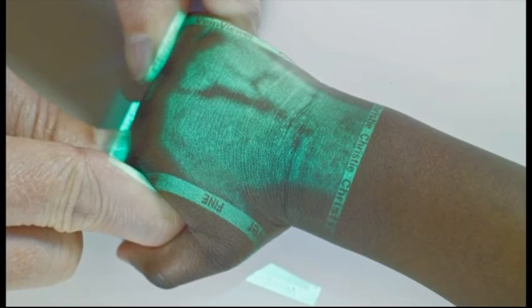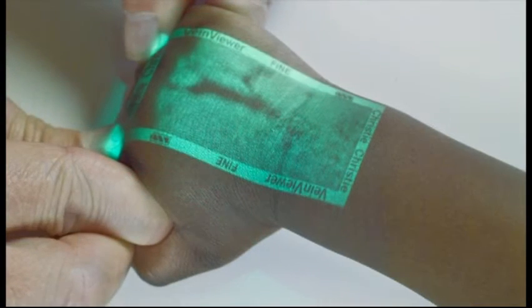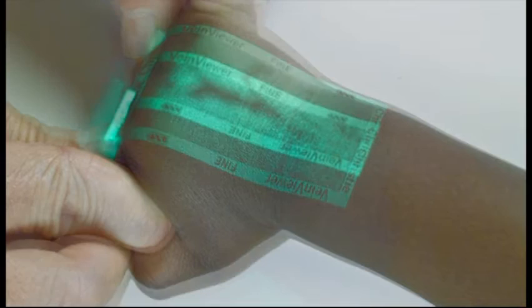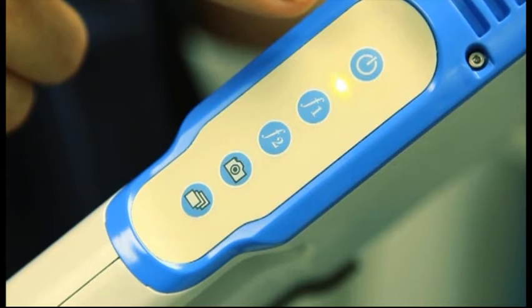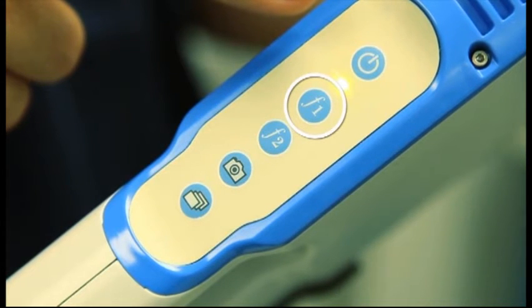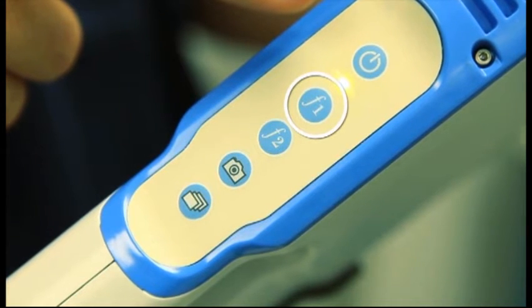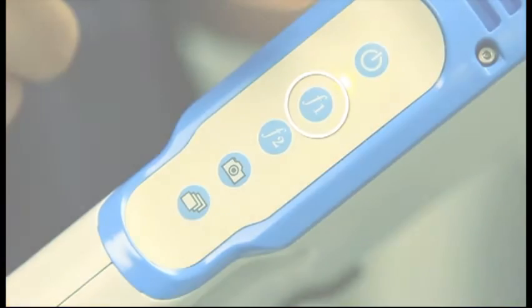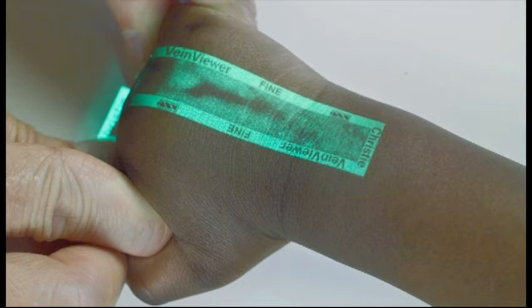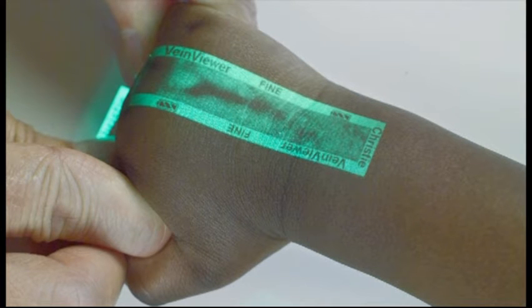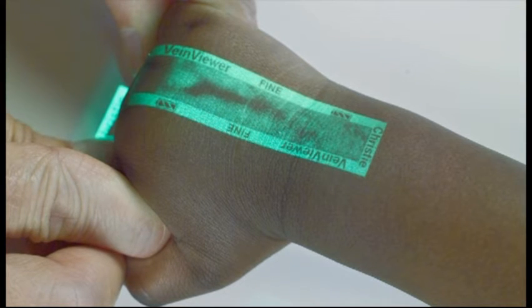The optional resize feature allows the window of the Flex image to be set to three different sizes. Once this mode has been purchased and unlocked, press the function button assigned to the feature during product setup. This feature is helpful with pediatric or neonatal patients where you wish to more carefully focus the VainViewer image on smaller appendages such as an arm or leg.